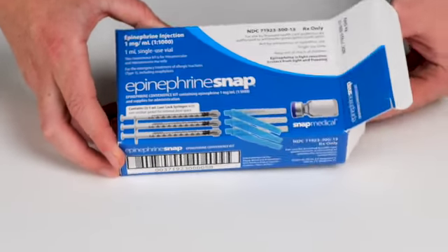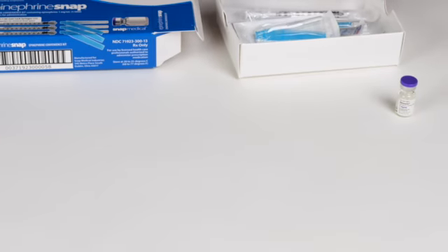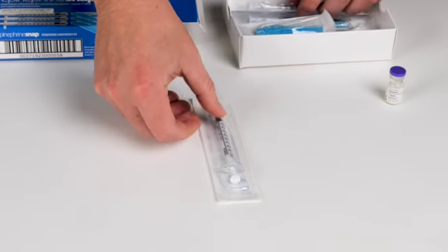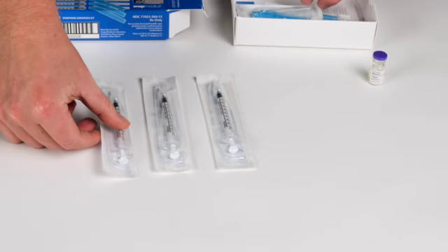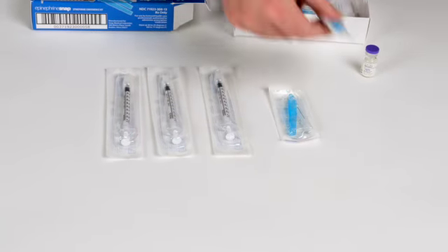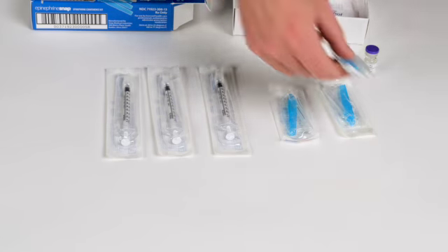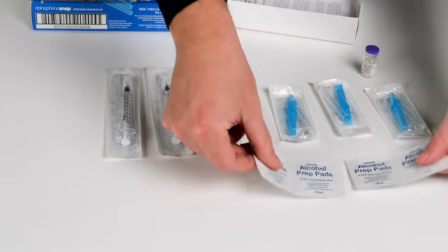The Epinephrine Snap Kit contains epinephrine 1mg per mL, 3 1mL non-residue gasket for minimal dead space syringes, 3 23-gauge 1-inch safety needles, and 4 alcohol prep pads.